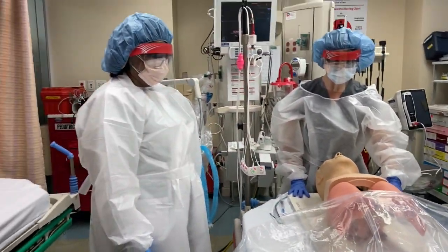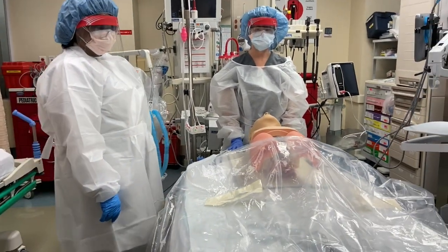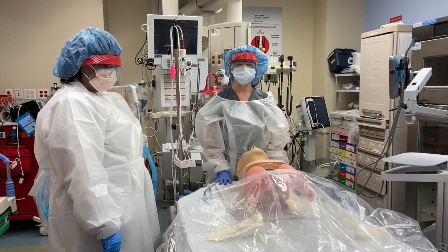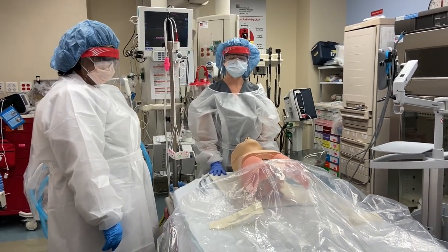The respiratory therapist and the vent will be to the operator's right as opposed to the left, as is customary in ED intubations. After pre-oxygenation, the patient is given an induction agent and high-dose paralytics for RSI.